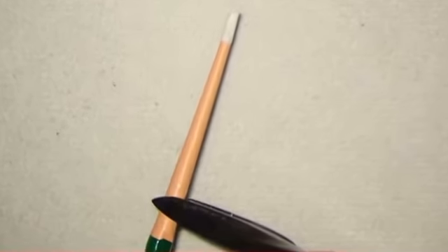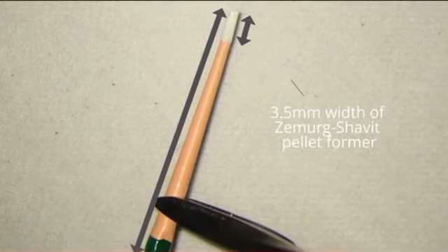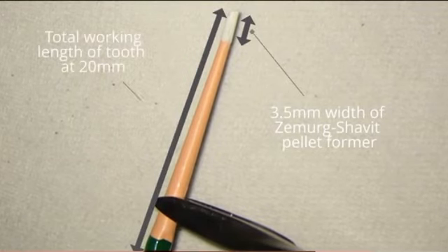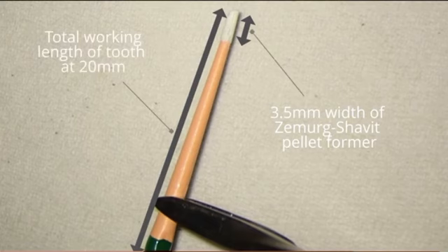We have 3.5 millimeters of the pellet on the end of the custom GP point, but the whole length of both the bioceramic plug and the GP point is the working length of the tooth.